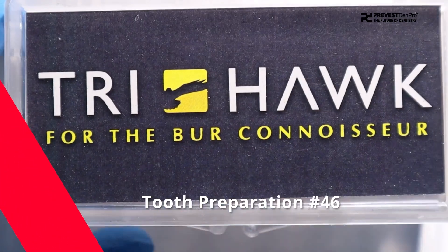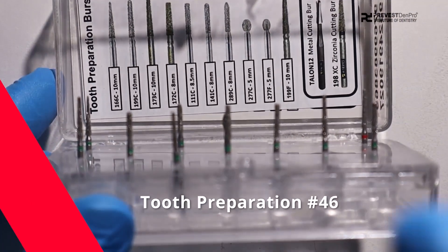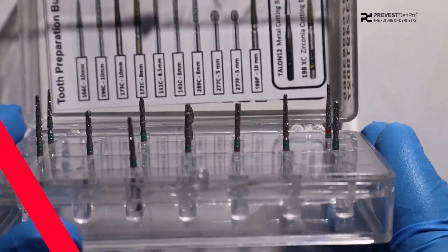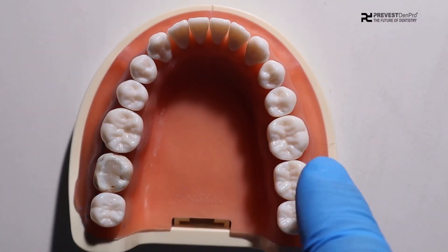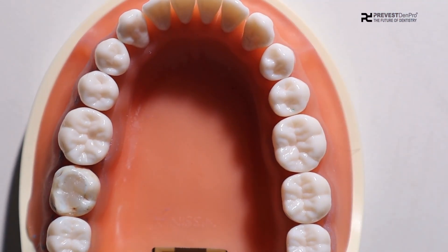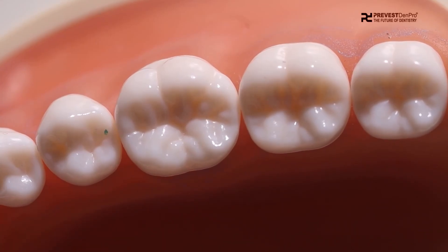After preparation of the putty index, our next step is preparation of the tooth. We will be using the tooth preparation kit with respect to tooth 4-6. Subsequently, after tooth preparation, we will move to the third step where we will use Oratemp C&B for temporary crown fabrication.